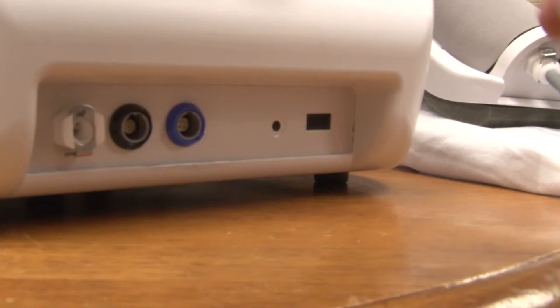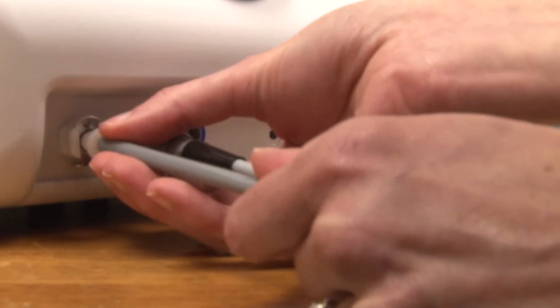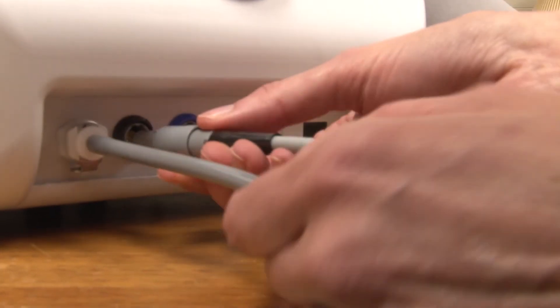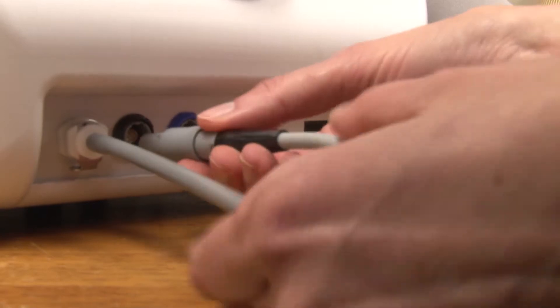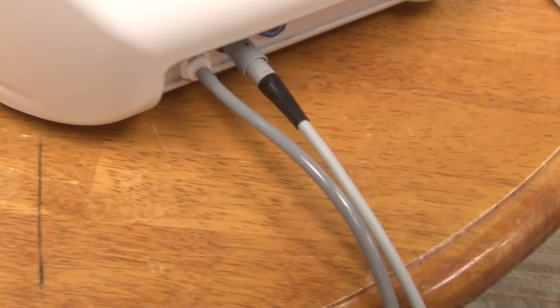Locate the front of the control box. On the bottom left side, you will notice a white outlet — insert the white cord plug here. Now take the gray cord and notice the black arrows on the cable plug. Make sure these are on top, then plug it into the outlet next to the white outlet. Make sure it clicks into place to ensure connection.